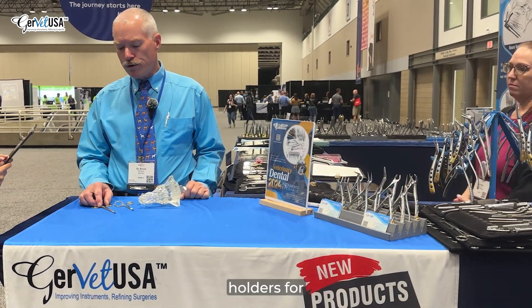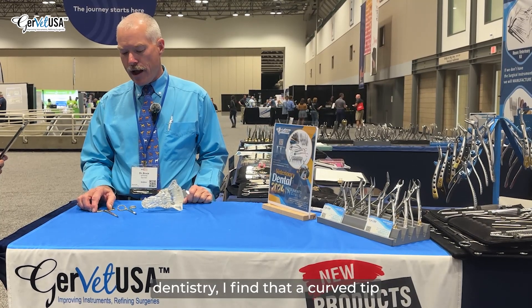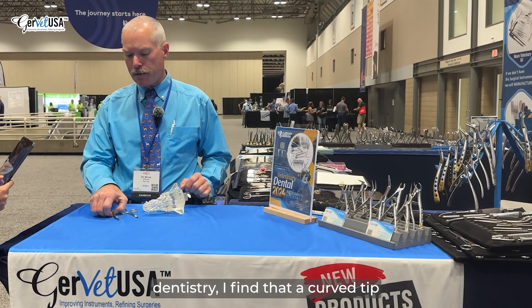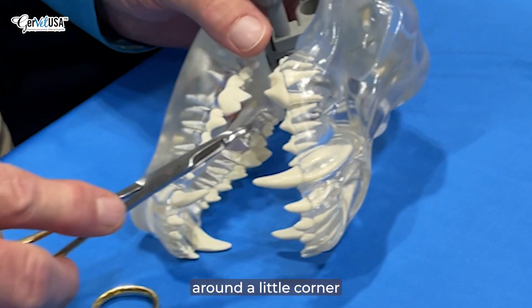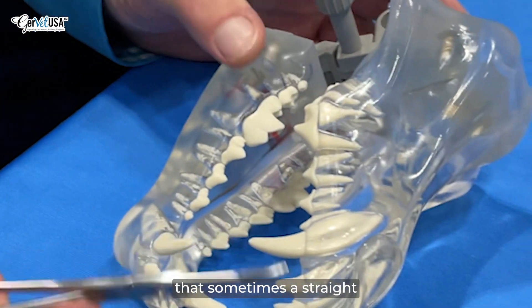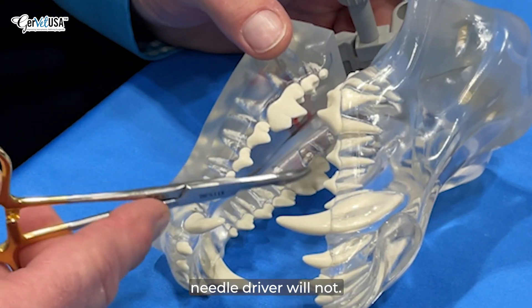When it comes to needle holders for dentistry, I find that a curved tip is very helpful because it'll just get you around a little corner that sometimes a straight elevator or a straight needle driver will not.